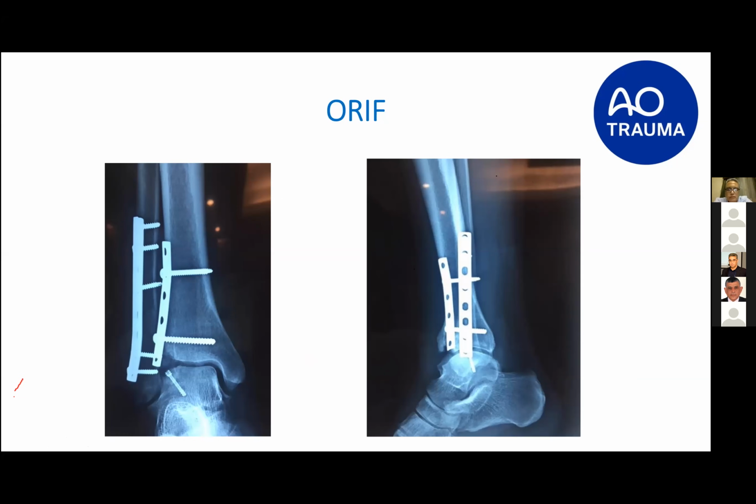And then, if so, why not remove this two-hole plate which is there now? This buttressing plate? Yes, because it's not buttressing the fragment now. Yes, I kept it for some time, but I actually came again and removed all the implants about 8 months after the surgery, because I just did not feel that I needed to take it out at the moment. But you have a point, Professor Hazem. It was not doing a job now because the fragment has been absorbed.